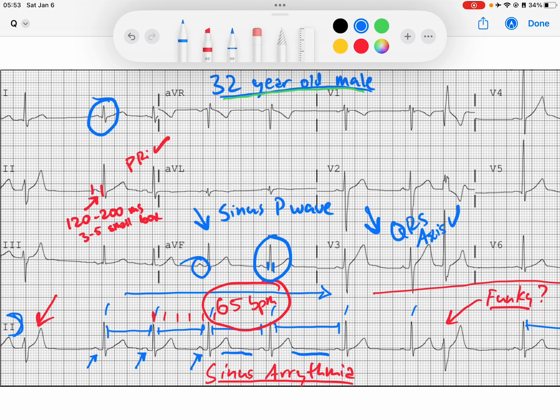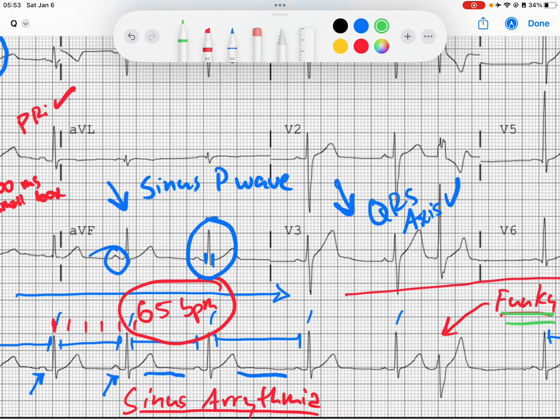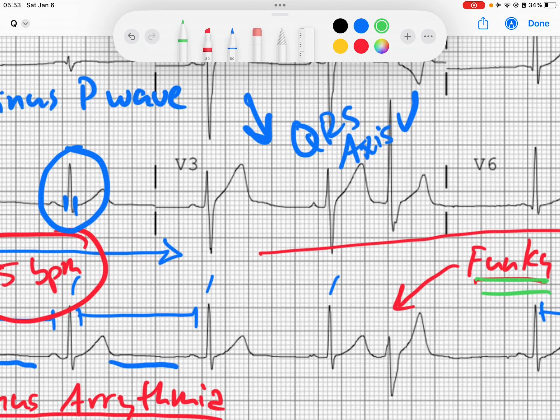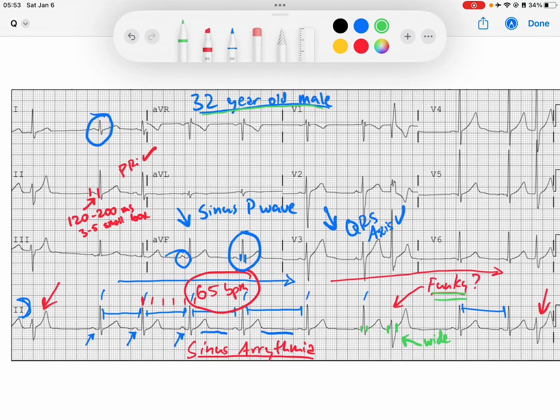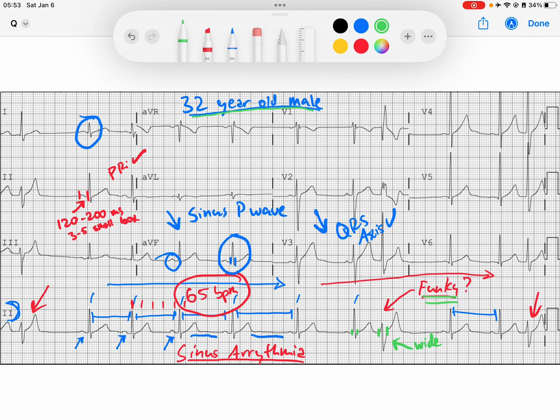Now we evaluate for STT wave changes and any pathological Q waves. I scan through and I don't see any in any anatomical distributions. Now let's return to these funky beats. Looking at the morphology of the QRS — I see that normal QRSs are very narrow, and these funky beats are much wider QRSs. So when I see a premature beat — notice these beats are all coming early — a wide complex premature beat typically makes me think of a premature ventricular contraction.